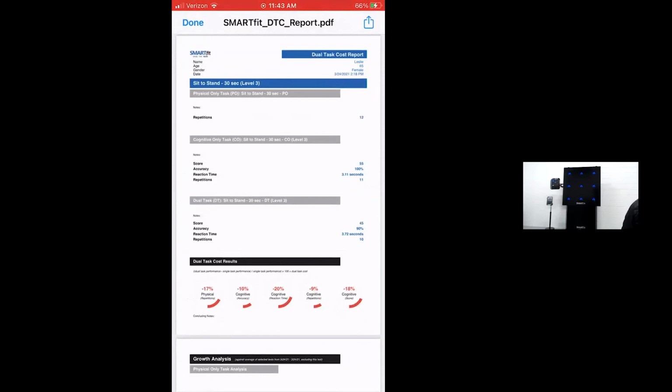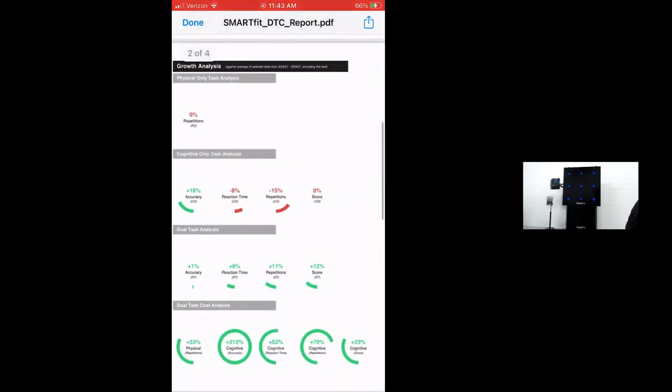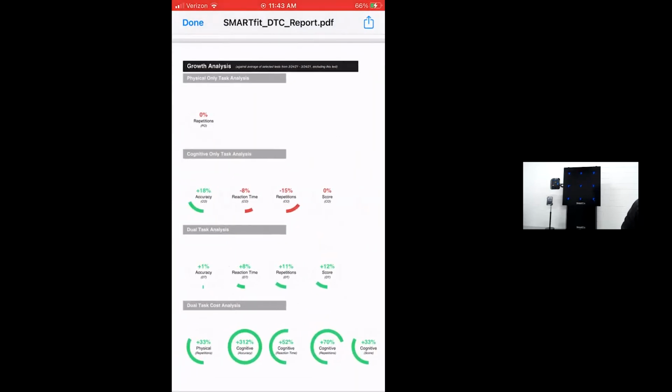So the first page, we've added 2 pages to this report now. The first page is similar to what you saw last time, okay, but it's just looking at the second attempt for this information. Now, this page you haven't seen yet. What we're going to be looking at is either an improvement or a decline. Did we get better or did we get worse when we retested? You can see the majority is all green, so we got better. That's a good sign. We want to get better.